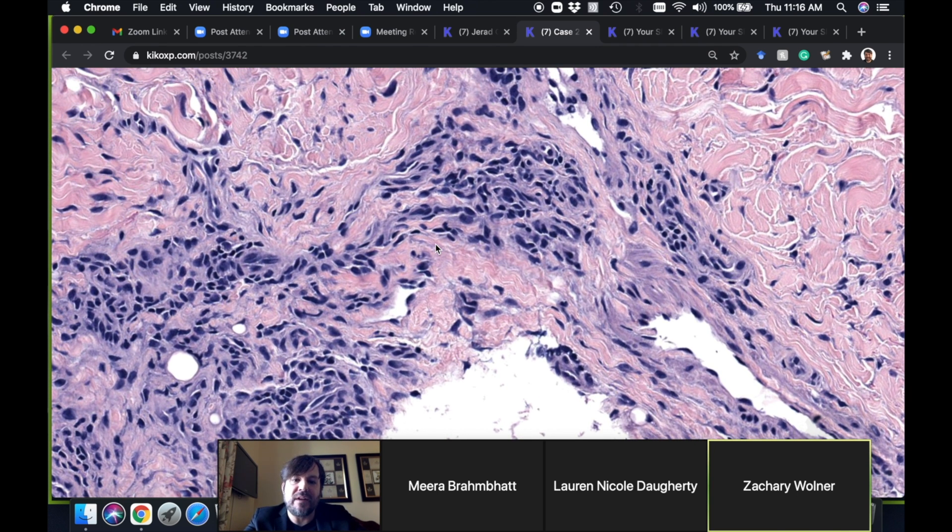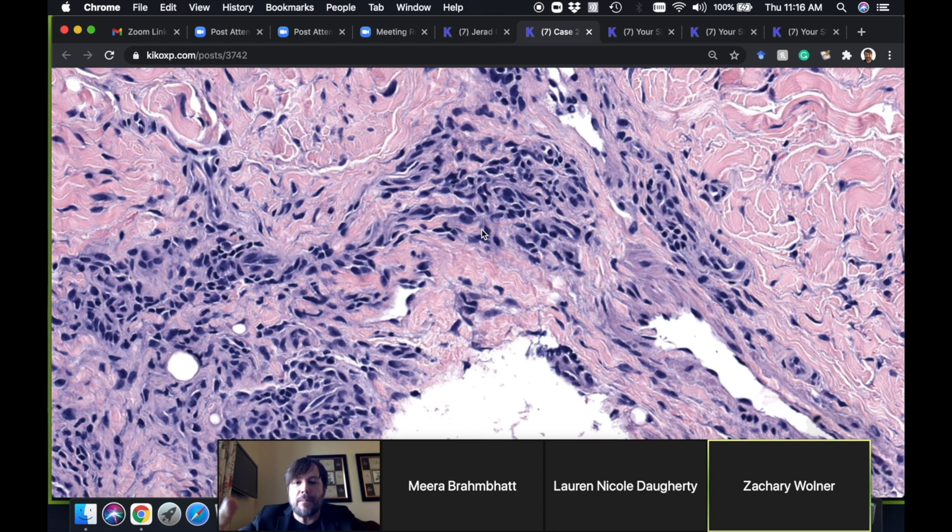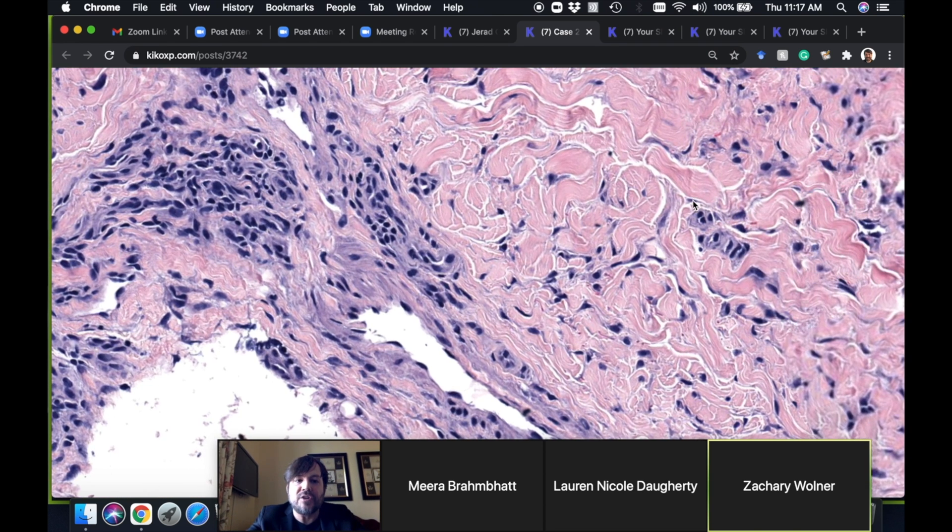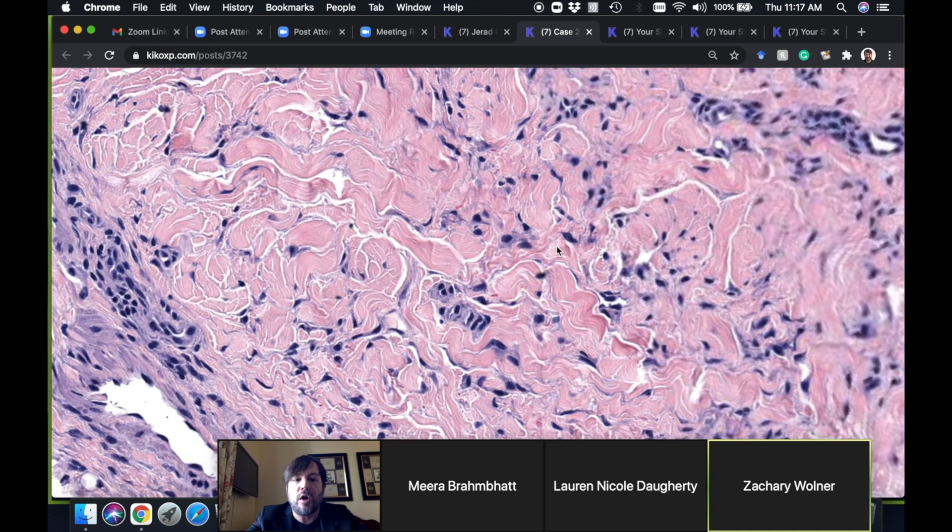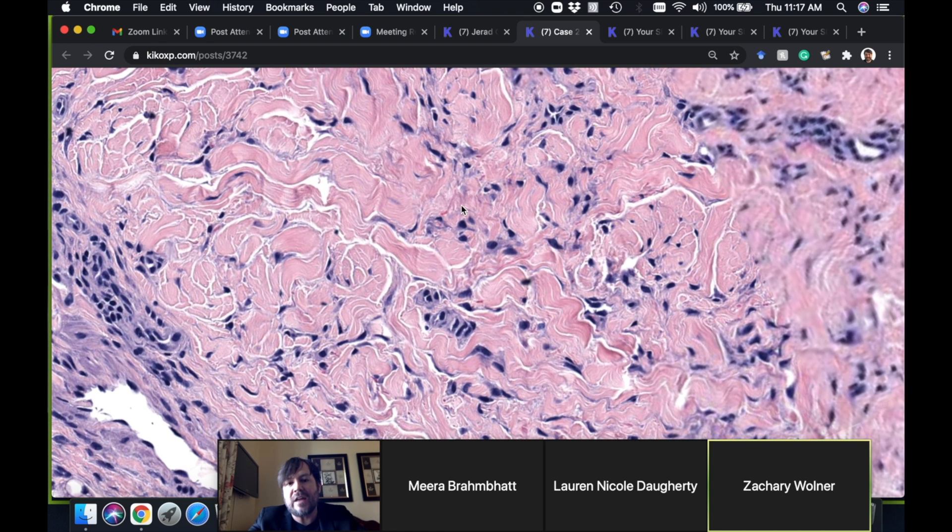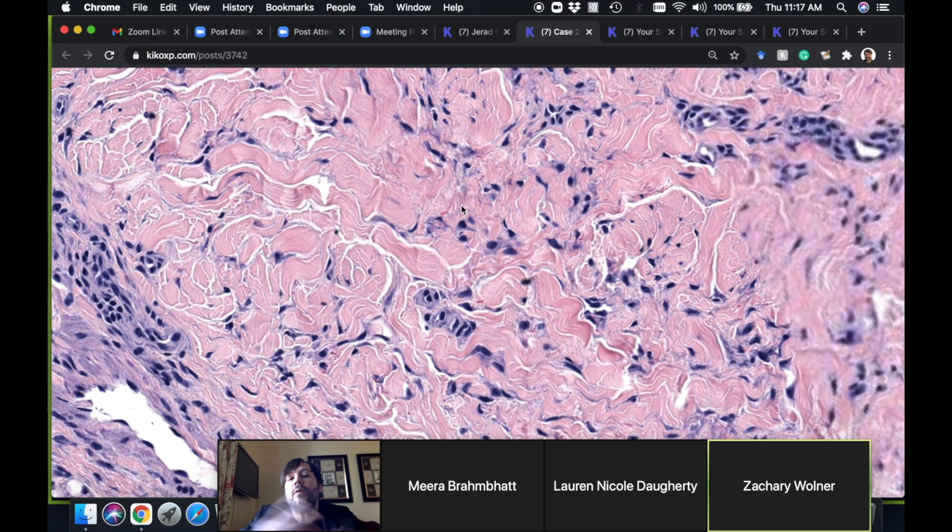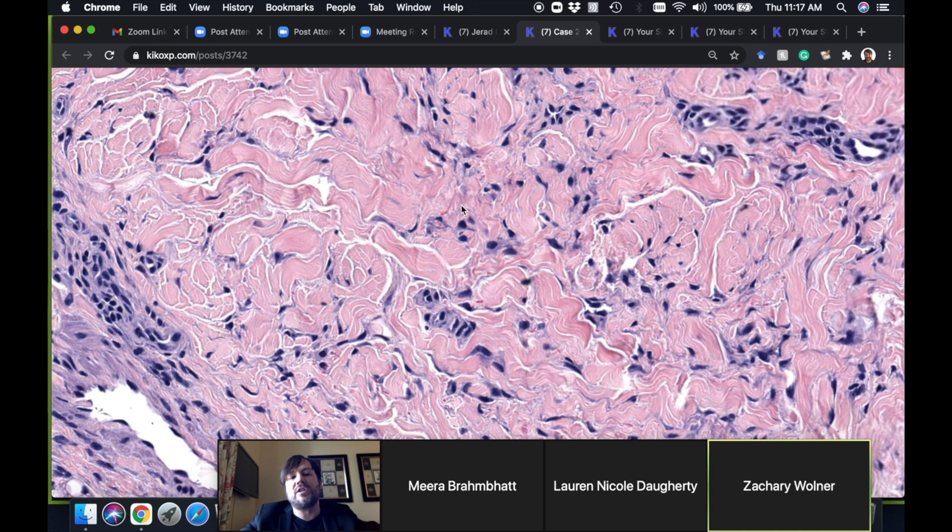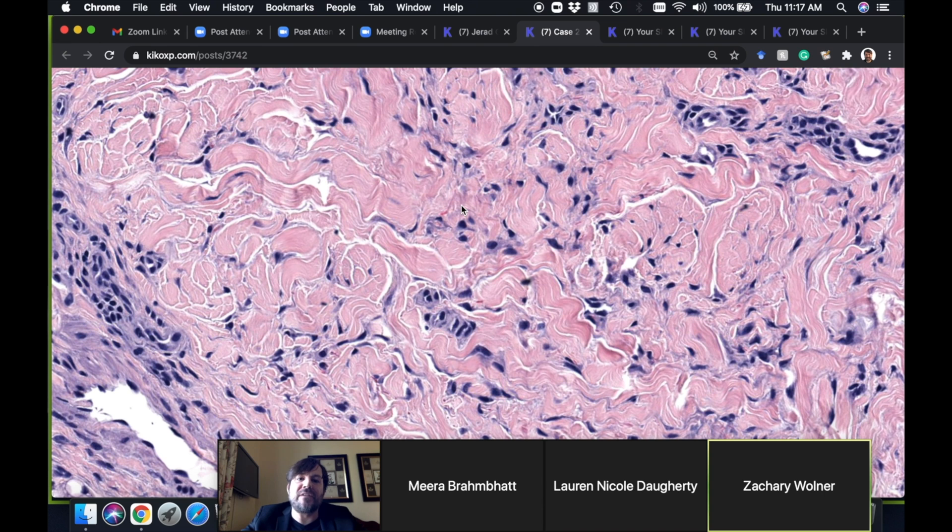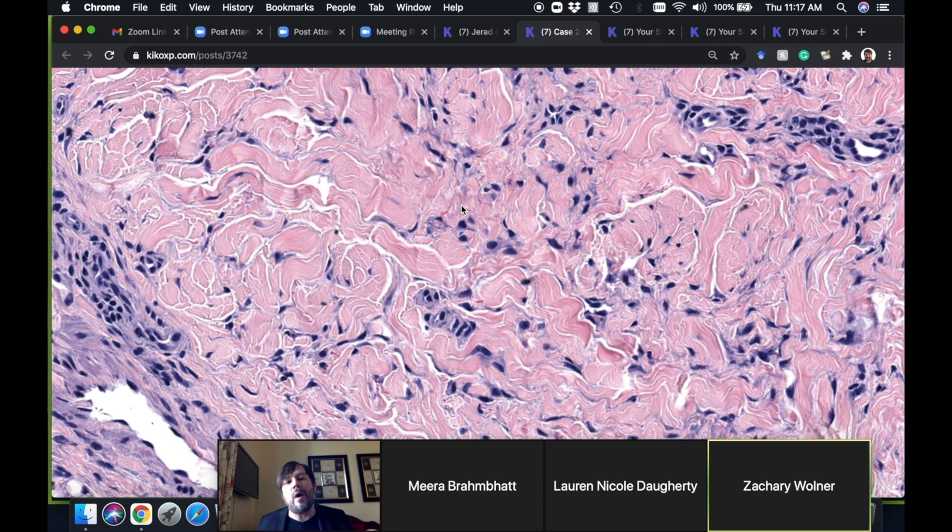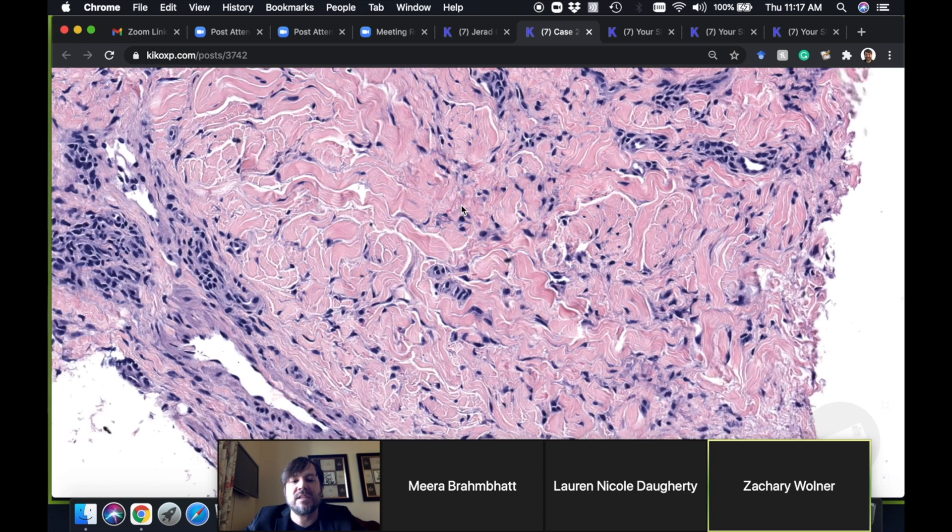When GA is completely composed of trickling histiocytes in between the collagen, we could say interstitial GA. But what I find much more often is that you just see interstitial areas at the edge of more well-formed classic granuloma annulare.